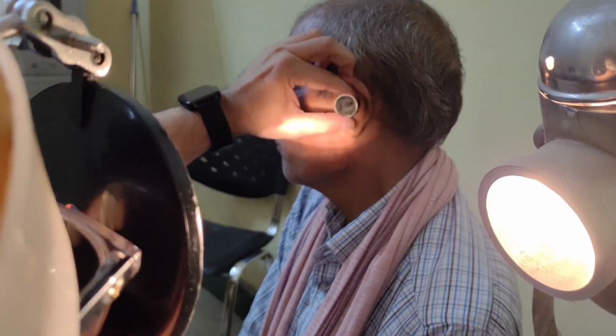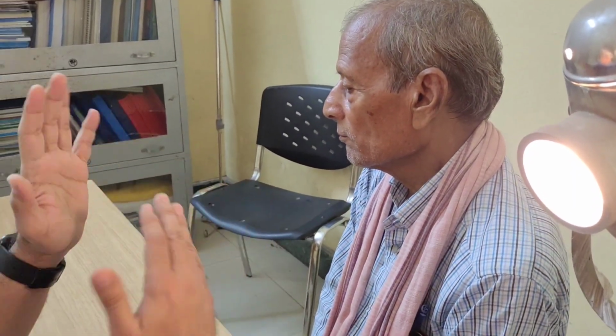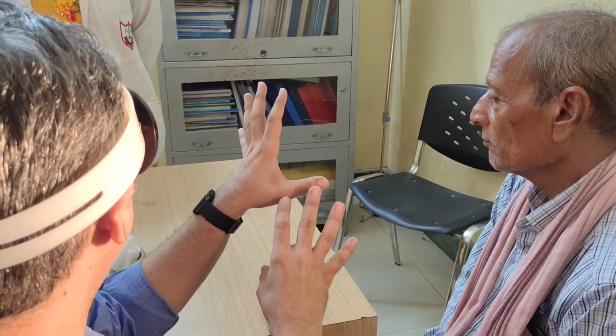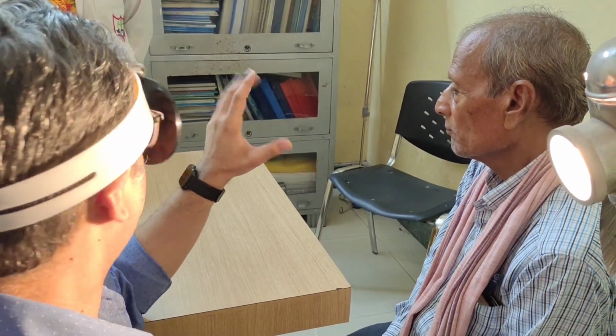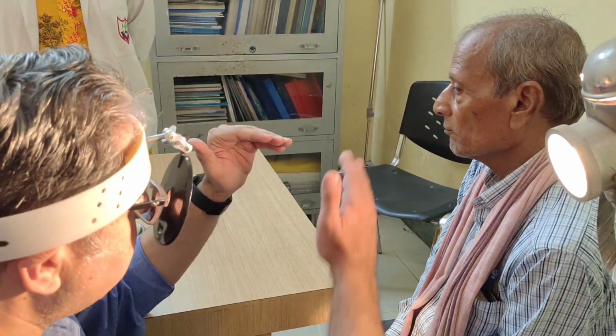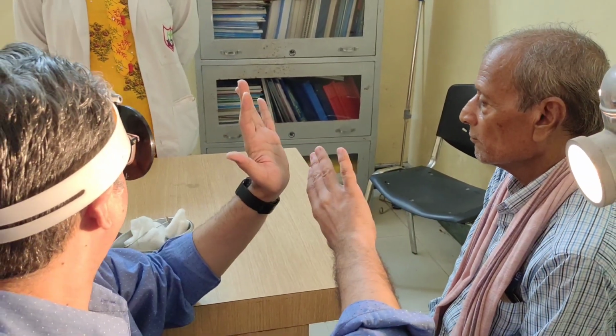Okay, so in per speculum examination, you are supposed to tell the remaining part, the bony part of the external auditory canal and the tympanic membrane. So again, you talk of the discharge, the debris collections, any foreign body there in the external auditory canal, and then you talk about the tympanic membrane. What points are you supposed to tell on the tympanic membrane findings? First is the position of the tympanic membrane, whether it is retracted, bulged or normal position.